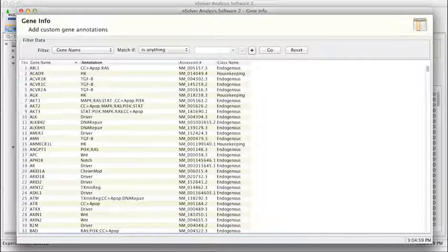It's important to remember that this field is a text field. If it is being used for ordering purposes within the analysis wizard, then it may be advisable to use letters A to Z in the beginning of this field so it sorts properly, as numbers are sorted as text fields. For example, 20 will be sorted prior to 3. These genes can be visualized and exported in all subsequent nSolver tables and visualizations for this code set.